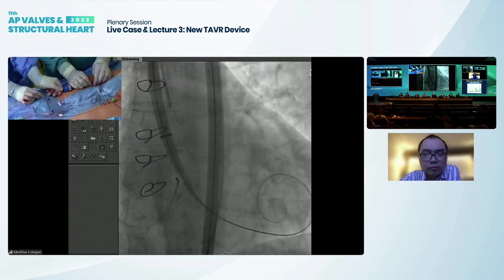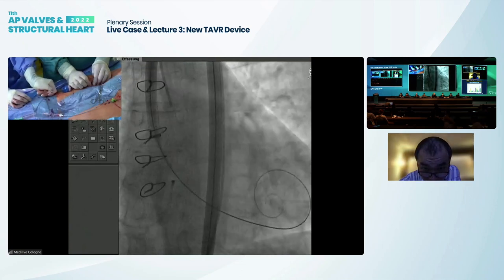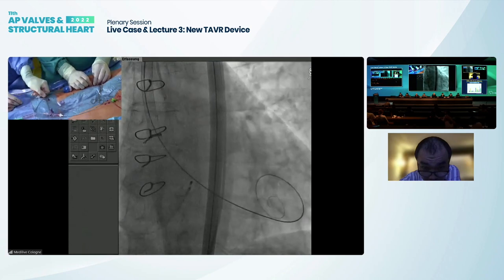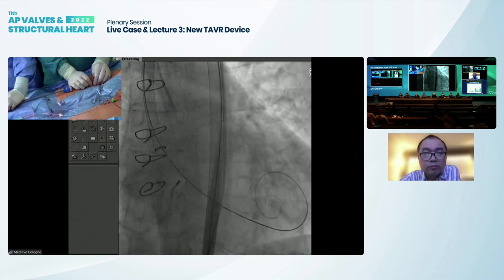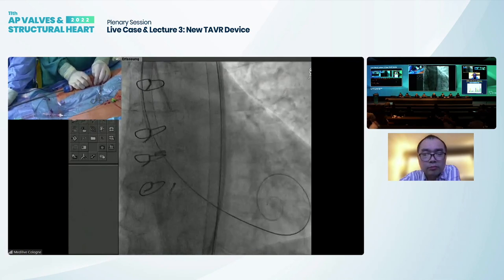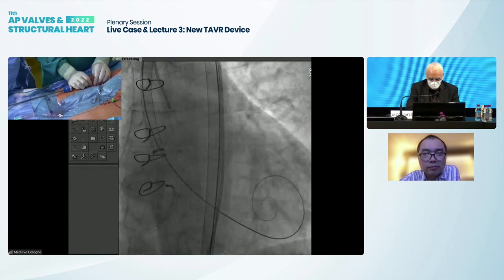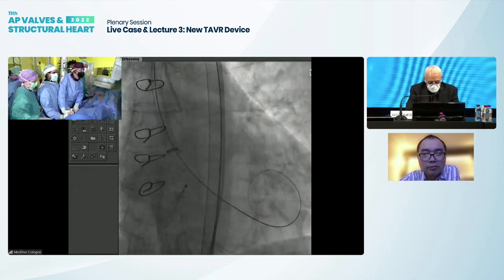So now the dilator is removed. And we do this very carefully, as the sheath might actually go a little bit out of curvature, as you appreciate here. So you can play with the wire a little bit and keep tension on the wire so that the sheath doesn't kink. Matti, hold tight. I will, Ivan. I promise. This is on me now here, Ivan. Yeah, I know.